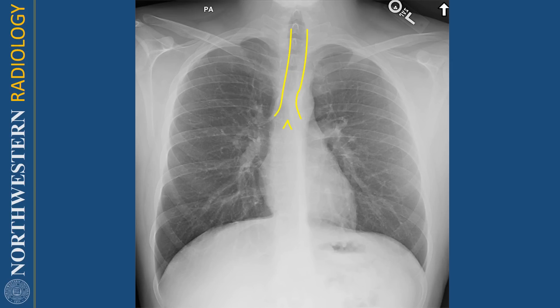Let's start by looking at the trachea. The trachea is this lucent tube extending from the top of the radiograph in the lower neck to the carina. The carina is this triangular shaped structure that divides the trachea into the right and left main stem bronchi. There's a normal deviation of the trachea to the right, which is due to the aortic arch, right here.